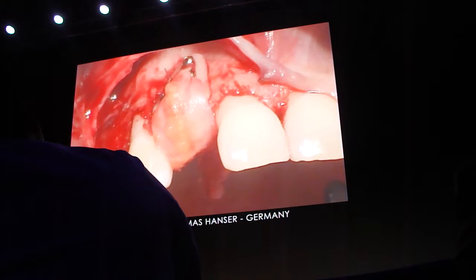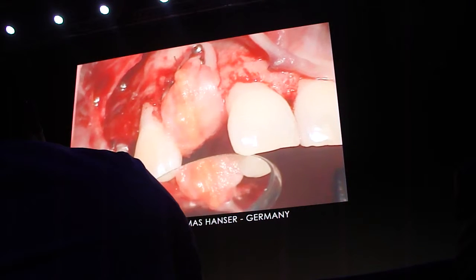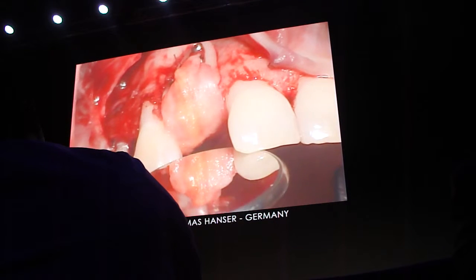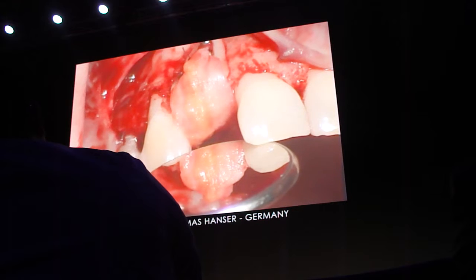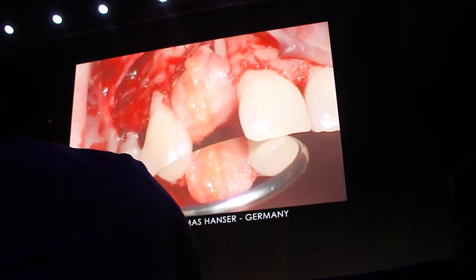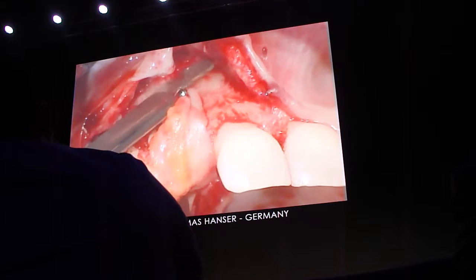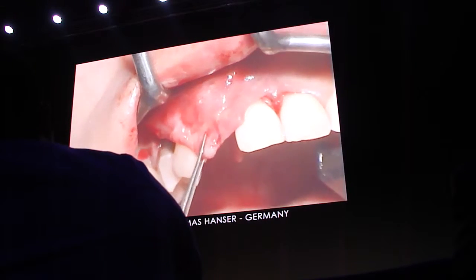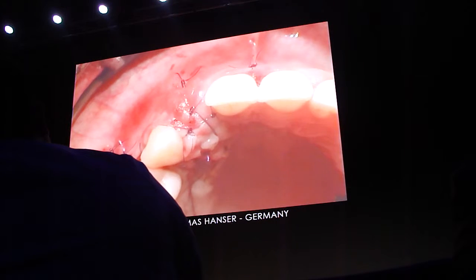We increase it vertically and laterally. Additionally, we are able to increase the keratinization in this area, the connection between the bone and the soft tissue, so the symbiosis between both of them will help us to create more stability long term. Essential to be successful in a grafting procedure, of course, is also to create a hermetic soft tissue closure.